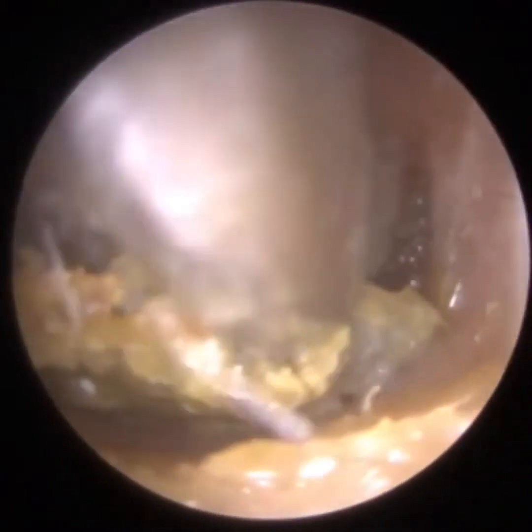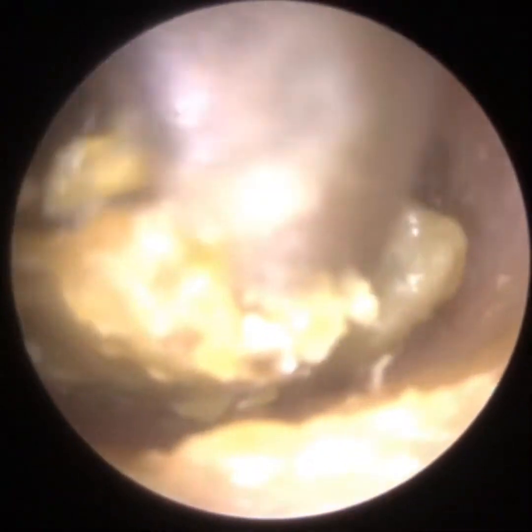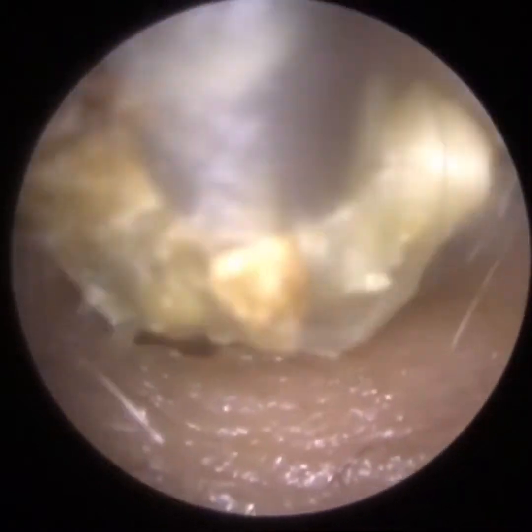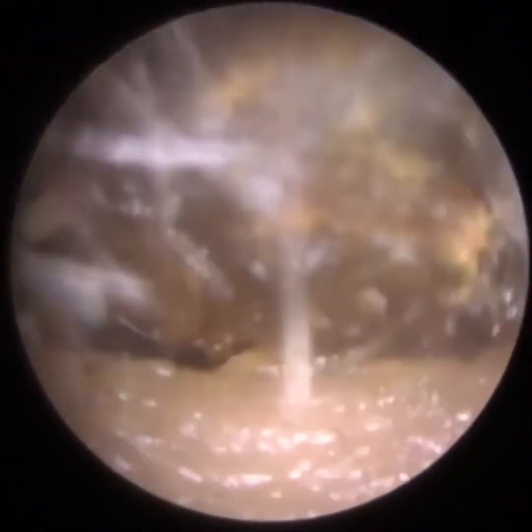It does actually help when the wax is a bit firmer like this, when you've got an anxious patient, because if it was all wet and gooey and slushy and mushy in consistency, it's a lot harder to remove, and you'd rather it come out in big plugs. Here we are. You see it's separated again.